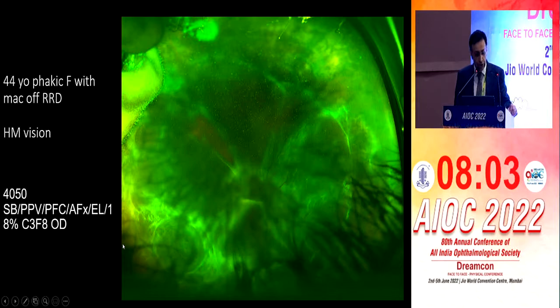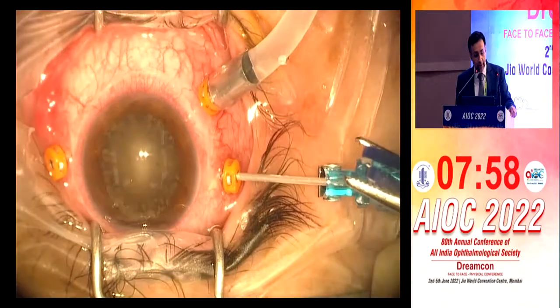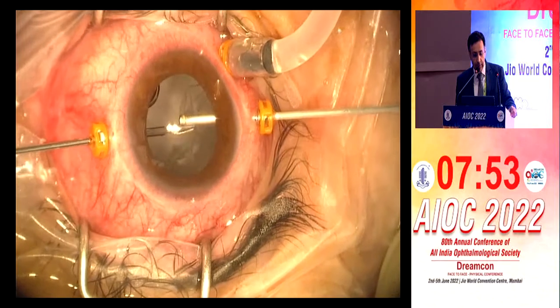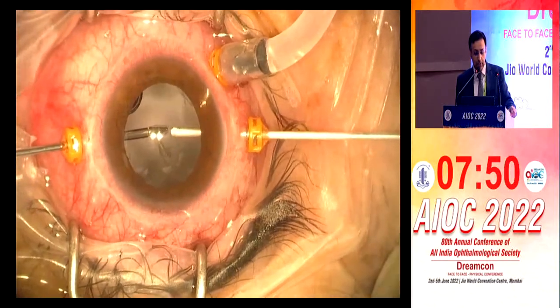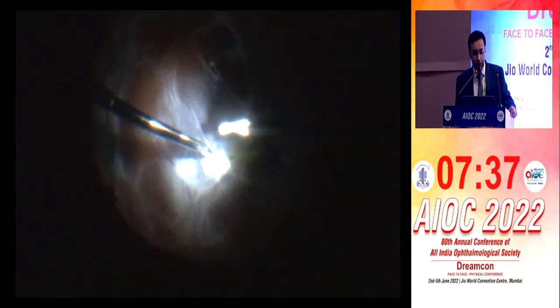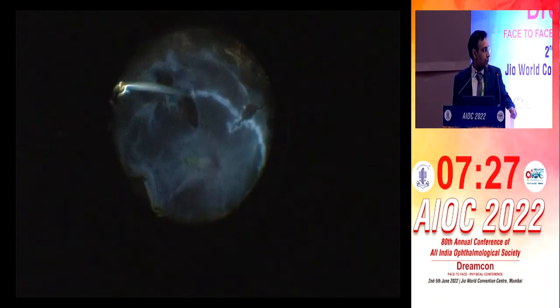There's a patient who is a 44-year-old phakic female with macular RD, very poor vision. This is the surgical video which he shared with us. The lensectomy is done; he's removing the capsule now. You can see it's a very bad case — there's extensive PVR and a huge tear. This is a bi-manual surgery with a spatula and the forceps. The spatula we don't use so much here; maybe in the U.S. they're using this.